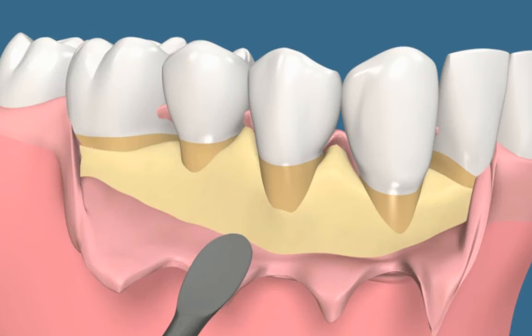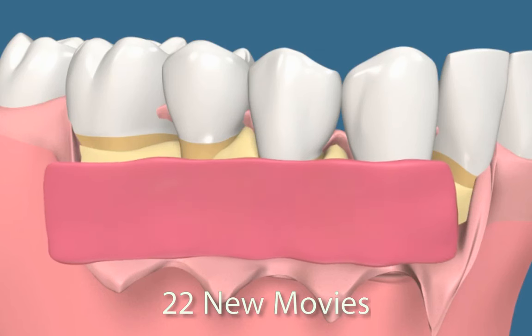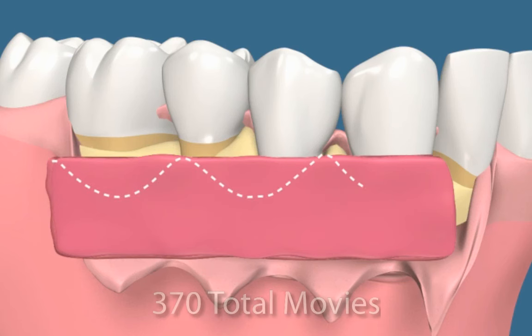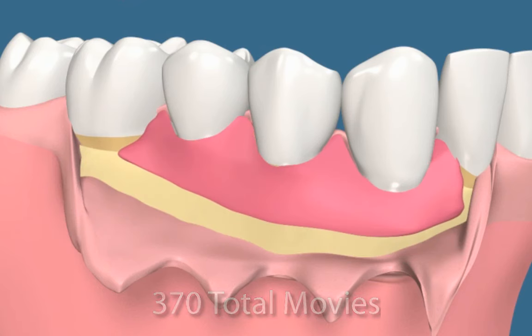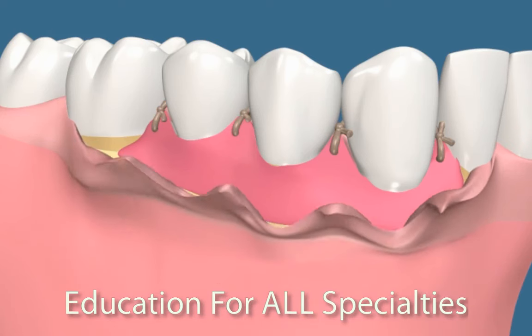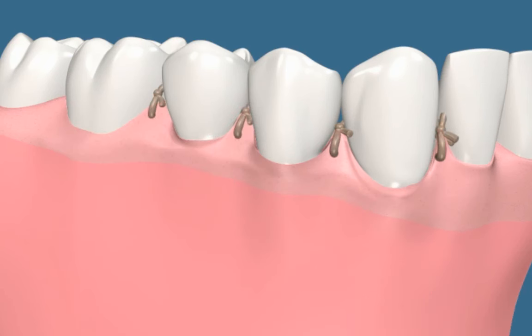Situation, the flap is reflected from the teeth. A prefabricated human graft tissue can be placed into the area. The graft is adjusted to fit and sutured into place. The flap is then repositioned back on top, covering the graft completely and sutured into place.